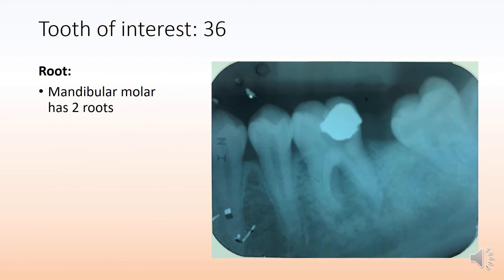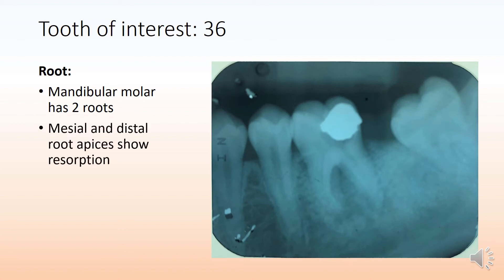Moving on to the root, the mandibular molar has two roots here, but what we can interestingly see is root resorption, pointed out by the yellow arrow marks. The roots appear fuzzy and the definition of the root apex can no longer be made out, which gives an indication of root resorption.